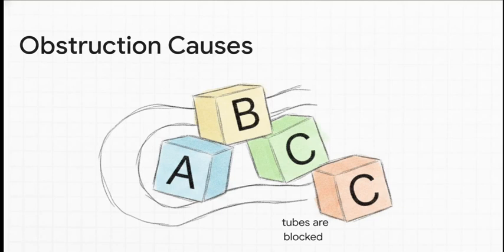Okay, so how do we memorize this obstructive bucket? Just think back to grade school and remember your ABCs: asthma, bronchiectasis, COPD, and cystic fibrosis. In every single one of these conditions, the tubes are physically blocked, the air gets out super slowly, the FEV1 plummets, and as you'd expect, that crucial ratio we just talked about drops low.